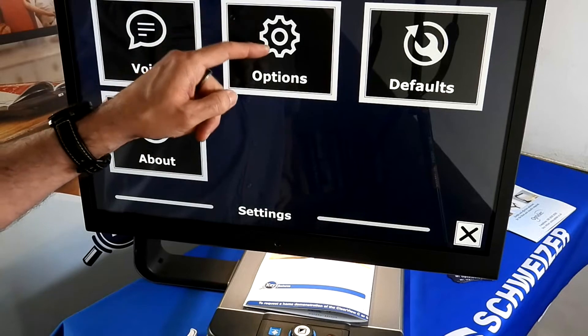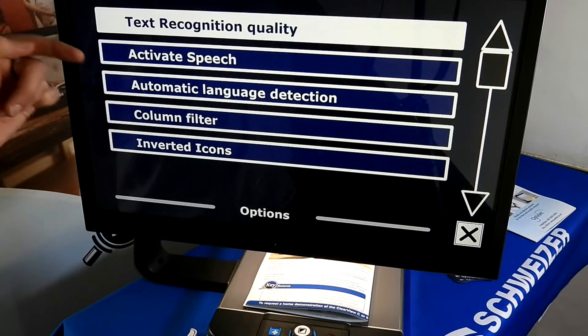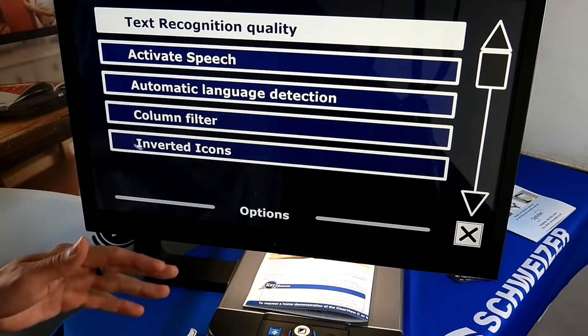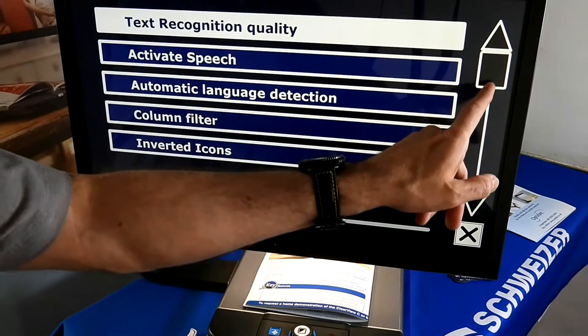The Options section allows you to adjust text recognition quality. There is also Activate Speech and Automatic Language Detection — so you don't have to always manually set up the languages; if you want it set to automatic, you can do that. Inverted icons and column filters are among the other functions available in there.